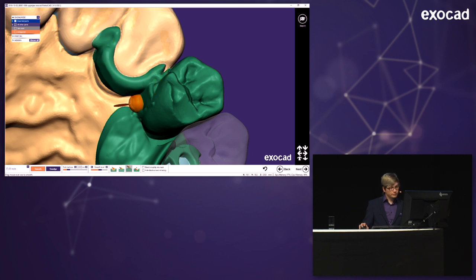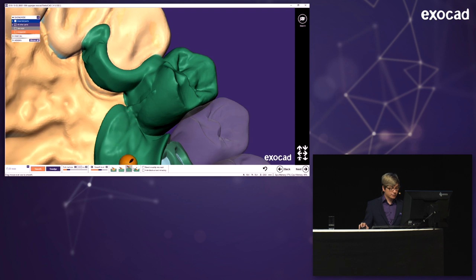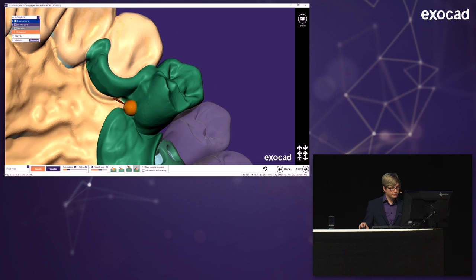So you see it's a kind of a middle way of adding, but also smoothing at the same time. So it really works like a real wax knife in the lab would work, which I think is pretty nice. You can also remove the material down here if you want to.